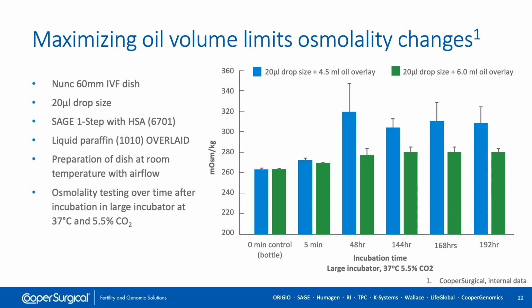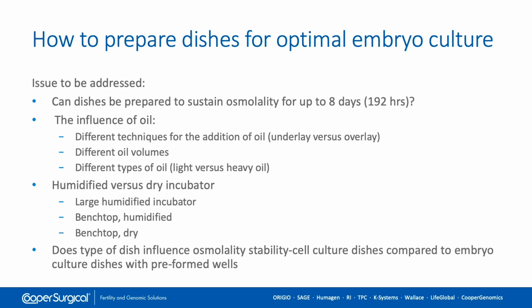So our dishes have to sustain osmolality for up to 8 days, mostly 5, 6 or 7 days, but can be stretched further. And of course, what influence does the oil have? We can use different techniques to make the dishes, whether we use an underlay or an overlay procedure, what type of volume we use, and the type of oil which we use. The light versus heavy oil changes in viscosity. Whether we use a humidified or a dry incubator will have an impact.